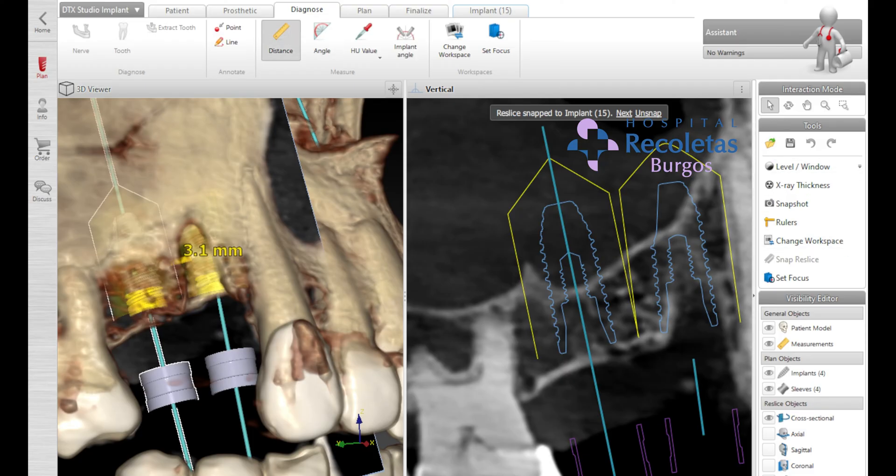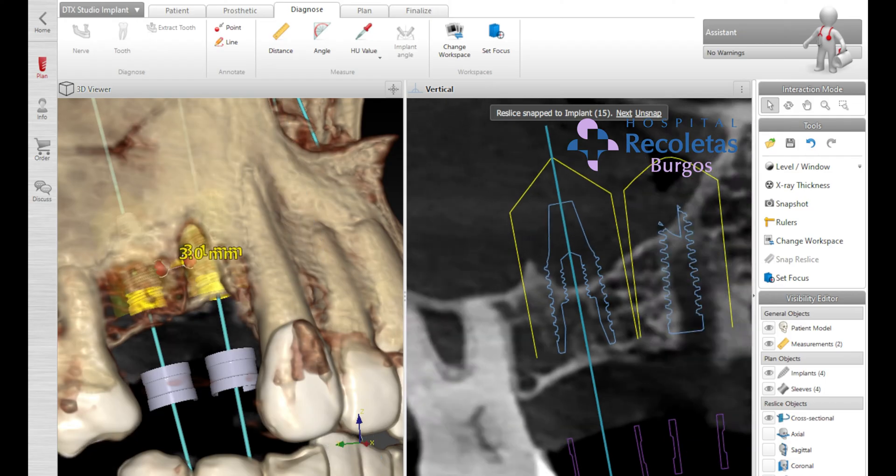If we take a look here, we have quite a tight space — talking maybe around three millimeters, which is kind of over the top of the minimum space we should have for proper bone grafting and placement of implants, but I couldn't do anything else. So we're going to place two implants, 3.75 millimeters, Novel Parallel Tie Ultra, and at the same time we're going to perform some bone grafting.